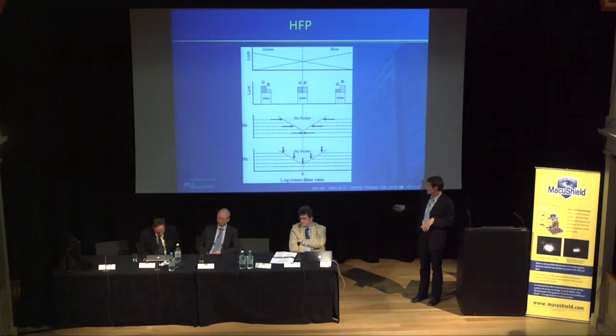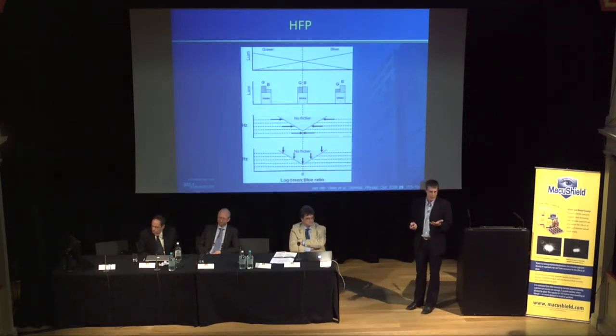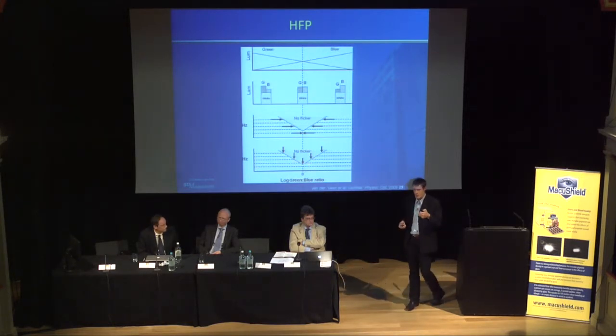If you wait long enough, at some point you see it flicker. But if you come closer to the point of your macular pigment, you have a harder time seeing it flicker, so it is at a lower frequency that you see it flicker. The idea is just to press a button as soon as you see something flicker. That's the task.